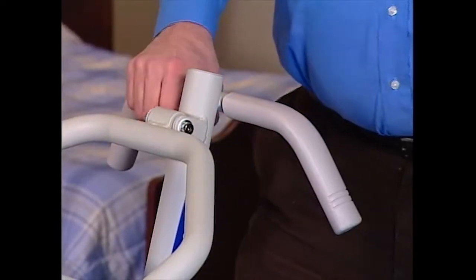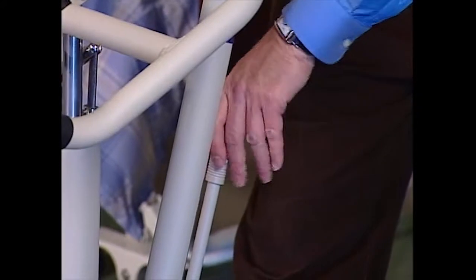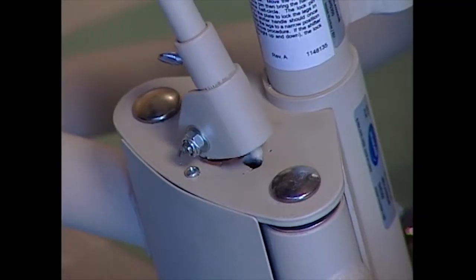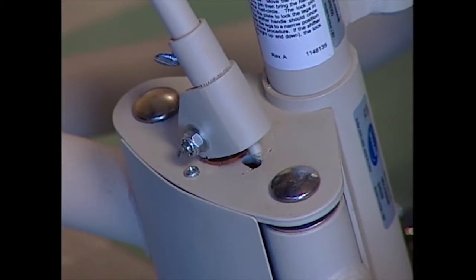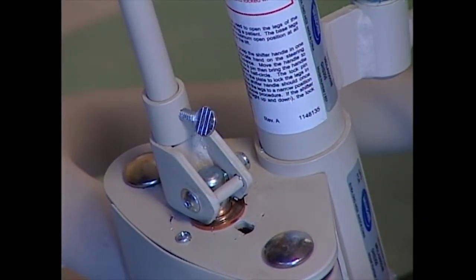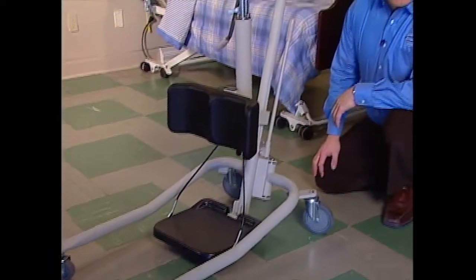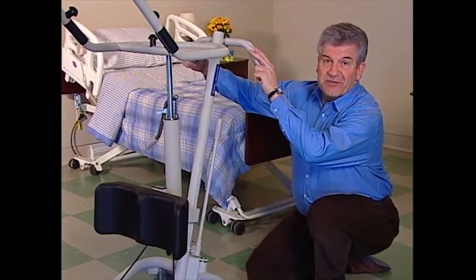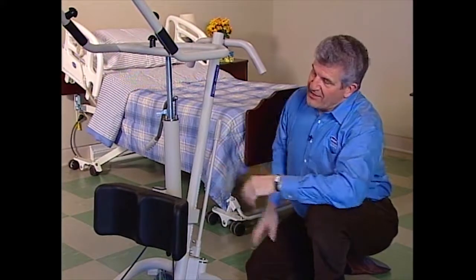To close the legs, just reverse the process. Grab the steering handle with one hand and the shifter handle with the other. Push the shifter handle to your left to release the locking pin from the open nested position, then turn the handle counterclockwise until the locking pin drops into the closed nesting position. The next assembly is the mast, where you'll find these ergonomically designed push handles and the hydraulic pump assembly, which does the lifting.